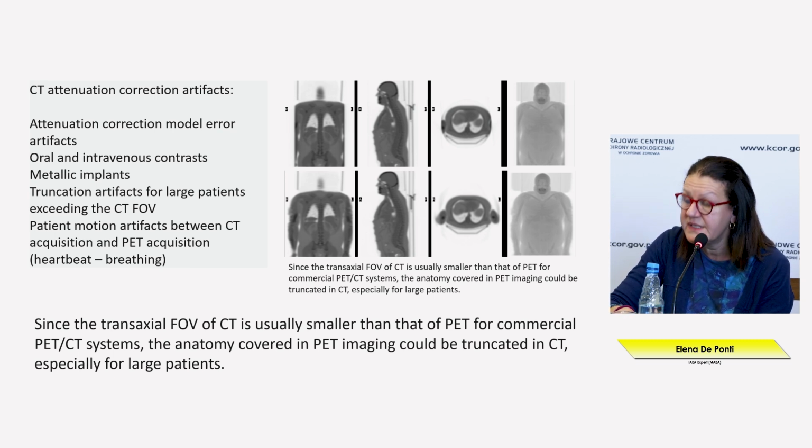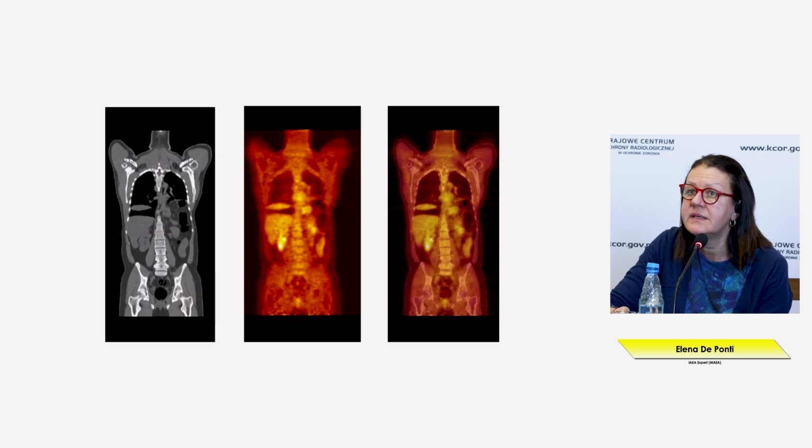For example, in this case, with some artificial intelligence tools, we can simulate the part of the body that is missing in the CT field of view.